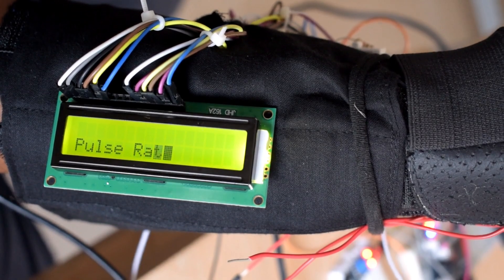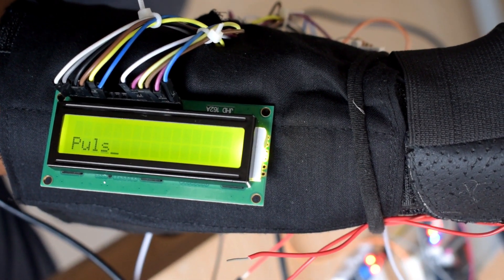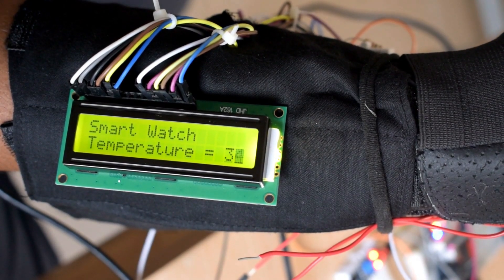We also interfaced a pulse rate sensor to measure the pulse rate of the user, and a temperature sensor LM35 to measure the room temperature. These values are displayed on the LCD.